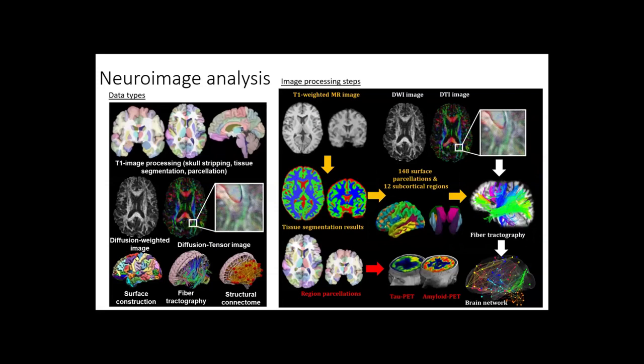Today I just covered the first part, which is for the MR. In the next lecture, Martin will be here to talk about diffusion weighted imaging, where we can see the orientation, which is basically the tensor image. Using today's pipeline, we can get the parcellation for each new brain.